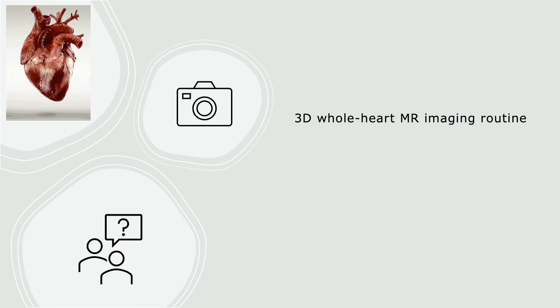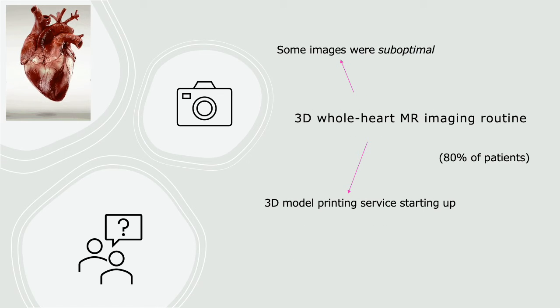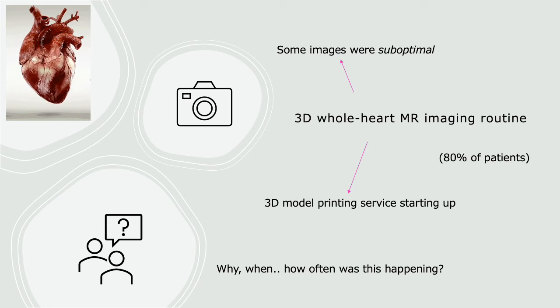3D whole heart imaging is routine in our scans. Around 80% of our patients will have this examination. But recently, they wanted to start up a 3D printing service within the hospital. Therefore, we required some really good quality images to be sent. However, we found some of the images were suboptimal. We weren't sure at this point why it was happening, when, and how often.